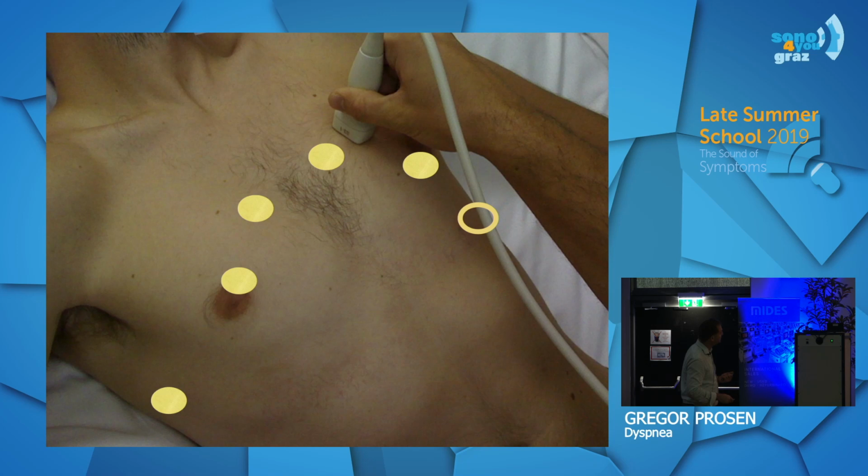So, as we said, the Röntgen, the chest X-ray, is like a summary view through the chest. But lung ultrasound is a localized view in each position that we view, like auscultation. Something here, something here, something here. So to make sense, you have to put the whole geographic pattern together.